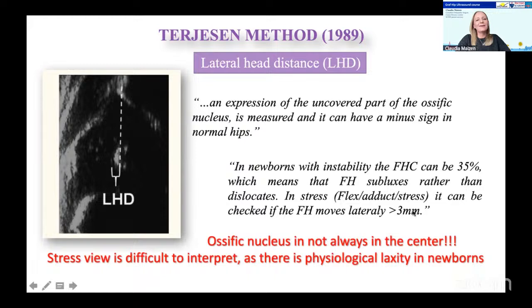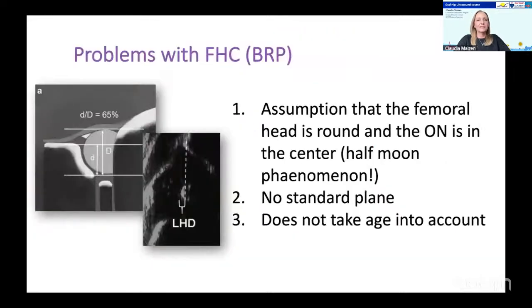Now, the issues we have is that the ossific nucleus, as we heard, is not always in the center of the femoral head. Also, we heard about the way that this picture is actually produced with ultrasound. The ultrasound waves are being reflected at the bony surface, which makes the femoral head appear more lateral than it actually is. And the stress views are difficult to interpret in very young babies due to physiological laxity in newborns because of maternal hormones, which only lose effect after around 6 weeks.